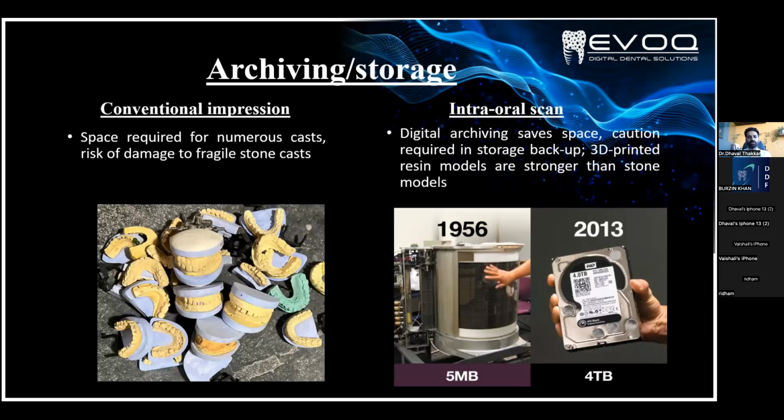Another thing is the storage. In a lab or in a clinic, we are used to storing n number of models and dumping them in our backyard. But with the intraoral scanner, we can just store our data on cloud storage, which scanners are providing free of cost, or any other cloud format like Google Drive, Dropbox, anywhere.